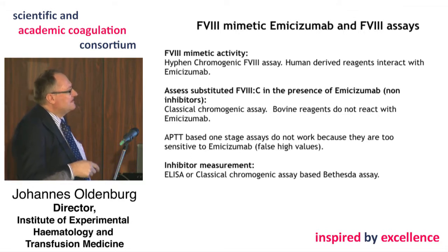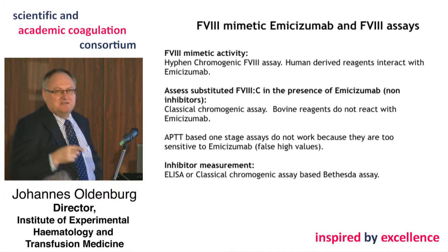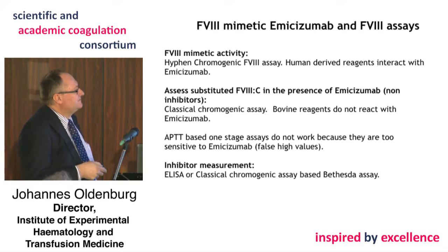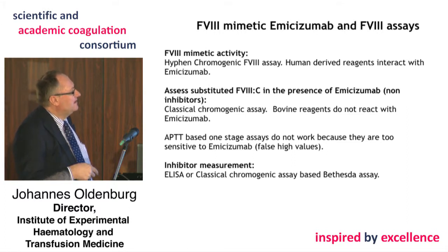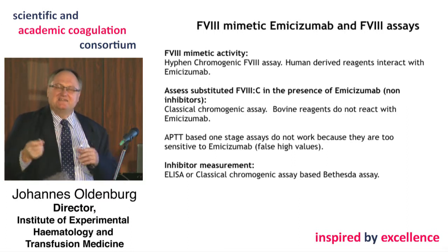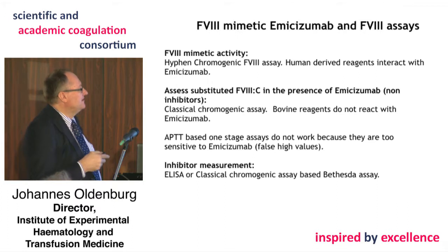If you want to assess substituted factor VIII:C, for example in case of surgery or bleeding, in a non-inhibitor patient in the presence of this bispecific antibody, then you have to use a classic chromogenic assay with the bovine reagents that do not interact with the antibody.